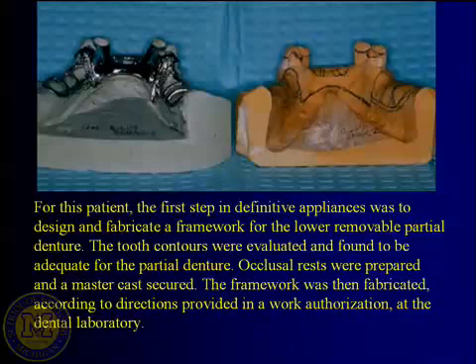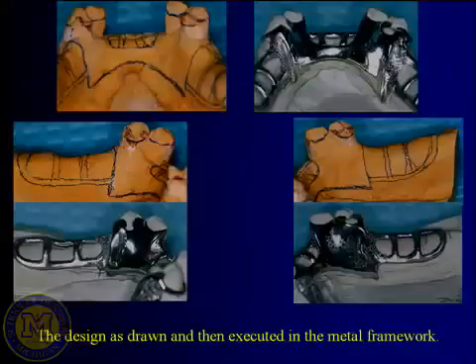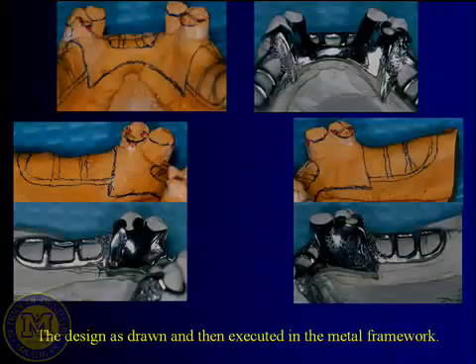Now in the whole sequence of things, can you see that you got to have the lower partial denture framework back in order to take jaw relations or biting relationships to mount the two casts? And so of the upper and lower arch, it's real critical early on to figure out if you need to do any tooth modifications to make a lower partial denture framework. Okay, go ahead and make the tooth modifications. So if you've got to reshape the lingual surfaces of any of the teeth, if you need to reshape the buccal surfaces of any of the teeth.